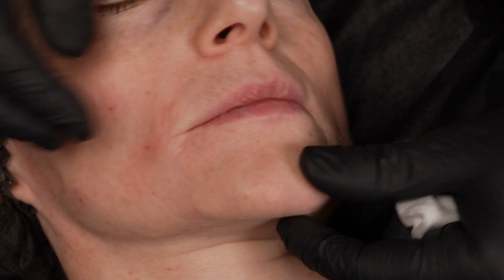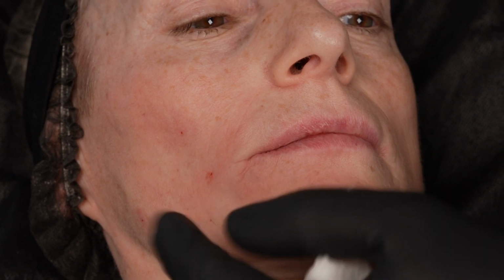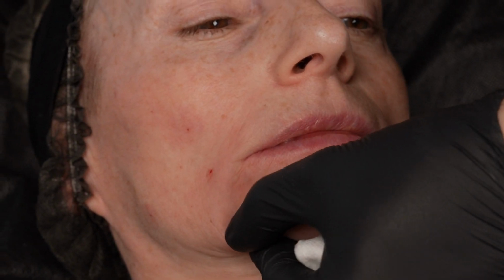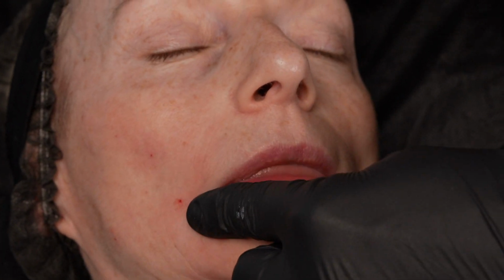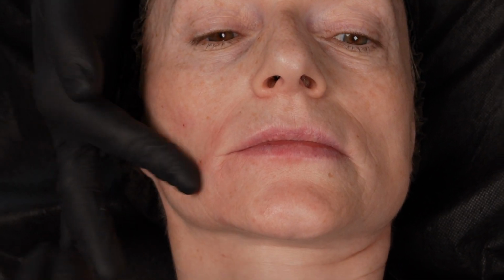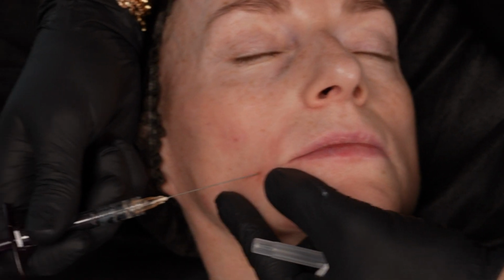Let's see. 1 milliliter has gone? So, 0.3 is left. 0.9 went to the correction of the perioral area. So we check. You see? 0.9. On one side 2 milliliters were used. How much do we have? More? 0.3. You can give a little bit here. Here is also a little empty. How do you do it? No, you can use the same entry point.